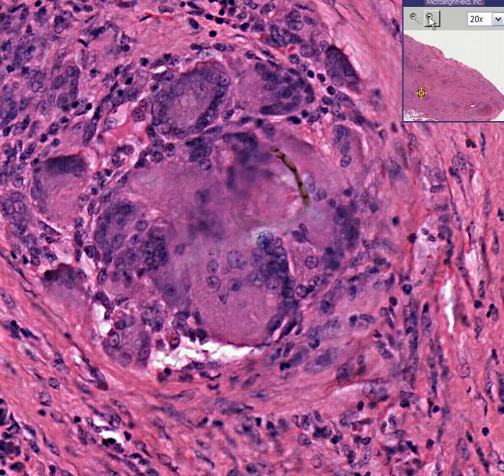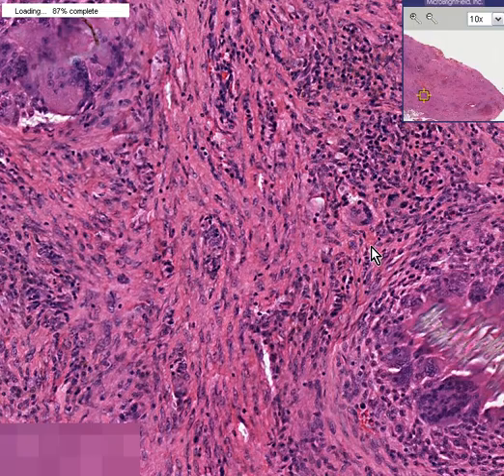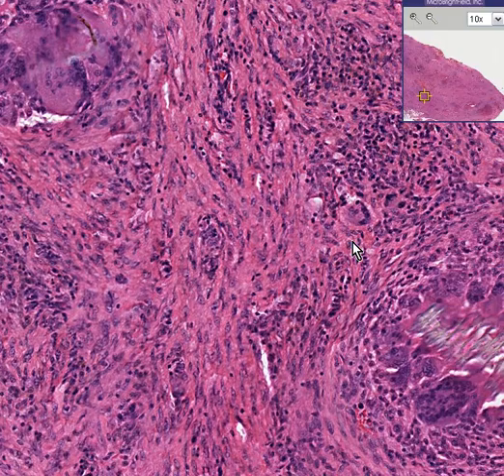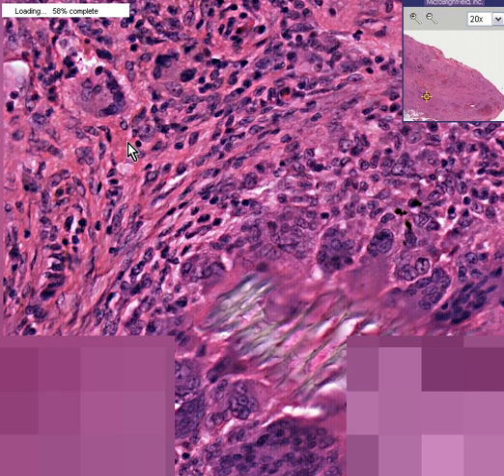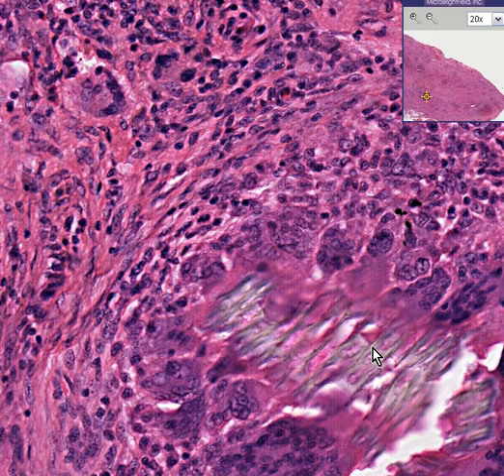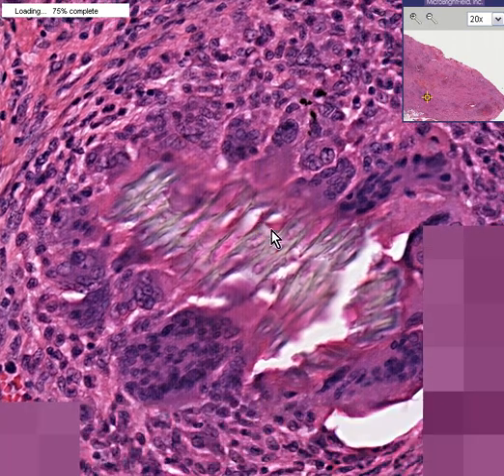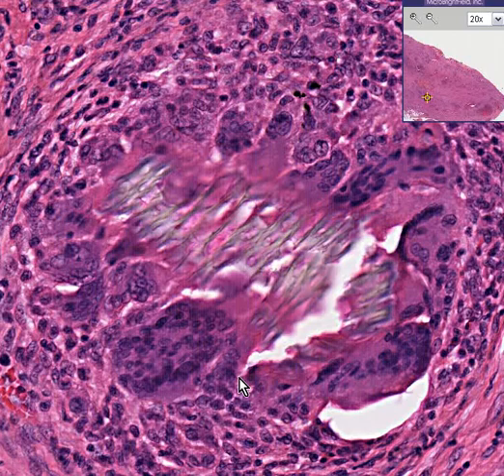So our luck in this case is that if we move along a little bit and find some more of these foreign body granulomas and giant cells — like we see here, here, here, and here — we can perhaps see the actual slightly refractile material that this is reacting to.